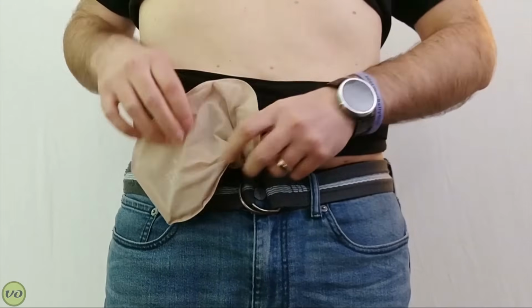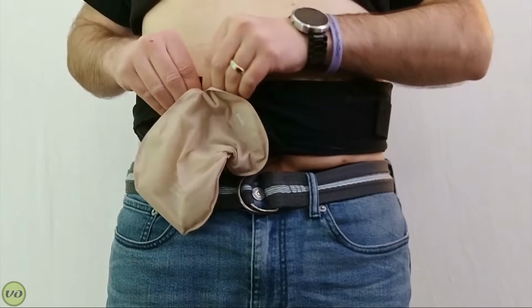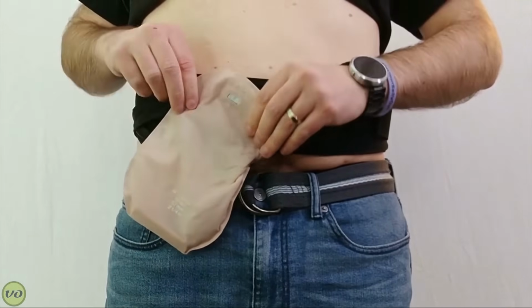Now a disadvantage with the two-piece with the adhesive coupling is the fact that you can't freely rotate it the way you would with mechanical couplings. Coloplast is the easiest to rotate just out of the box because that locking mechanism basically tightens the whole flange in place. When that locking mechanism is detached, then you can actually rotate the bag pretty easily. With something like the Hollister or Convatec or other brands, that's not as easy to rotate, although you can still do it, and I have a trick for doing that. But some people might just actually remove the bag, rotate it, snap it back on, and then you're good to go.